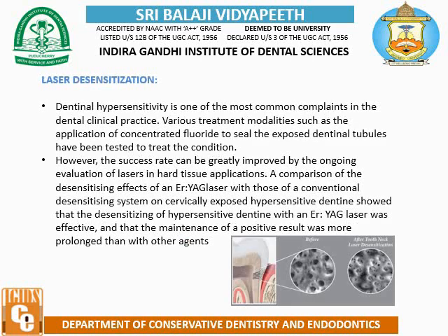Laser desensitization. Dental hypersensitivity is the most common complaint in dental clinical practice. Various treatment modalities, such as application of concentrated fluorides to seal the exposed dentinal tubules, have been tested to treat the condition. However, the success rate can be greatly improved by the ongoing evaluation of the laser in hard tissue applications.